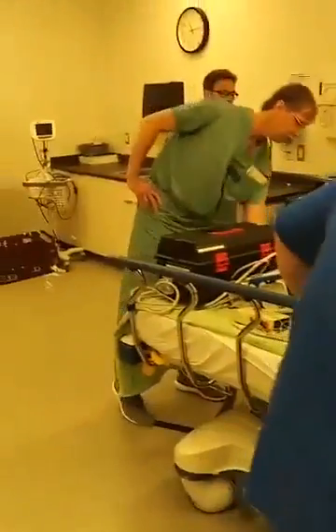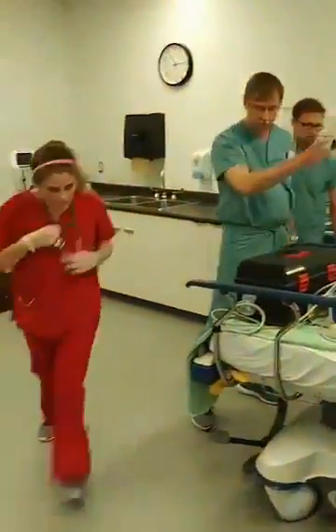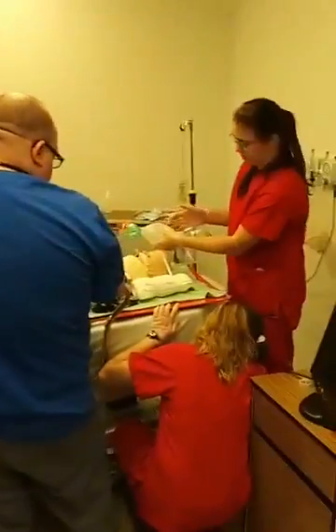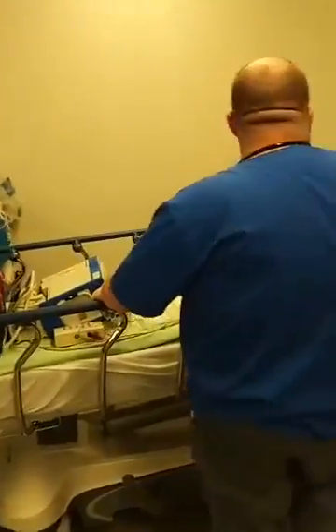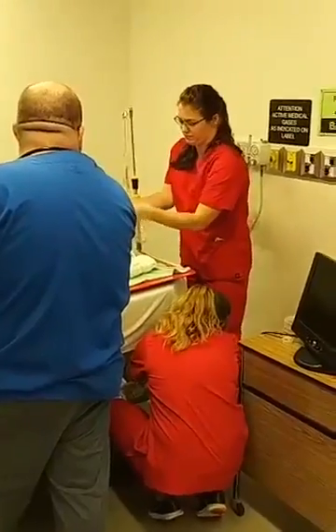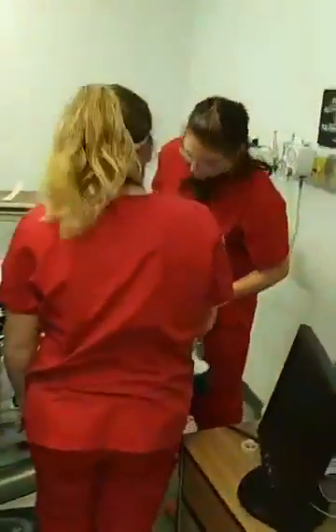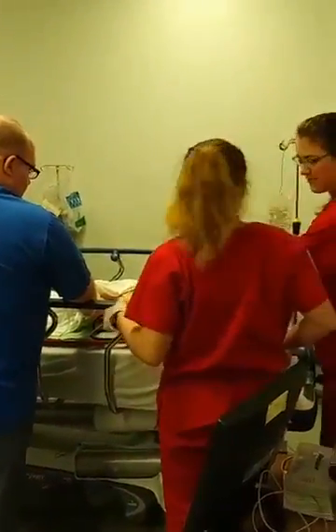And we'll disconnect and switch back to the tank. Okay, oops, sorry. You good? Yep. Okay. Kyle, you ready? I'm ready. Let's go. Just need to get ready to disconnect and attach to the cylinder. Okay, so you're ready? Just tap it. Okay. How you doing, guys? Ready to get moving? Yeah. Did you guys want to bring the backboard, or are you okay without it? Let's bring the red board. We got it already. Got the red board? Yeah. Okay, all right, good, lots of support, excellent.